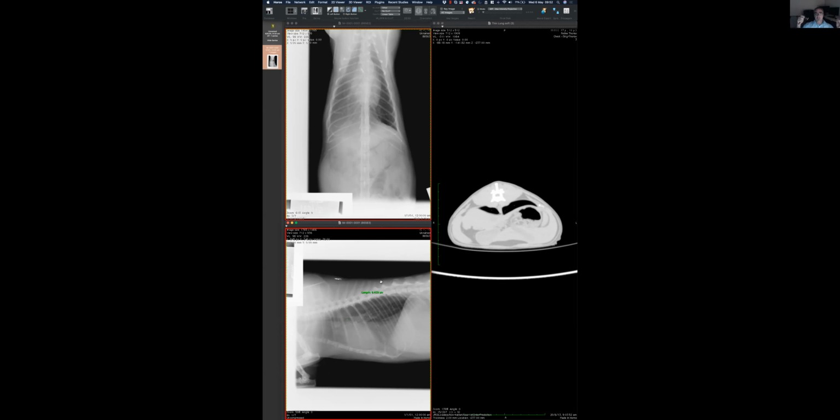But then there was a question: is it a lipoma? Is it a diaphragmatic rupture? I don't see the interruption in the continuity of the diaphragm. So a reasonable next step, depending on your surgeons, who may say, look, I'm happy with this, I can take a look at the whole diaphragm. And if we go that way, I remember we had these two options: is it a purely intra-abdominal disease, a fat opaque mass, or is it a herniation? And I think that was the justification for the CT.